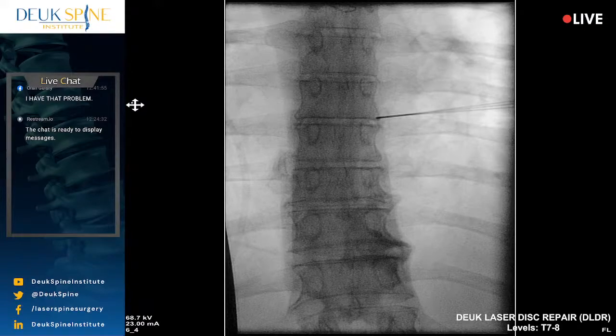Right? 9, 8, 7, 7, 8. I believe we're at the 7, 8 disc. Everybody in agreement? Excellent.